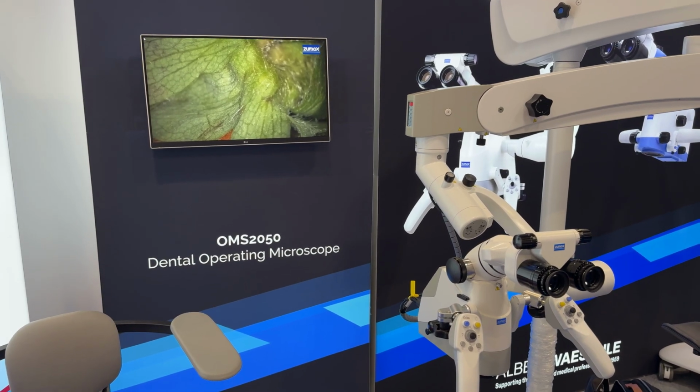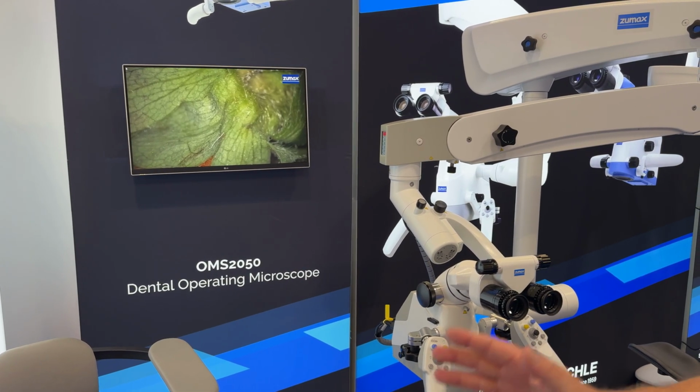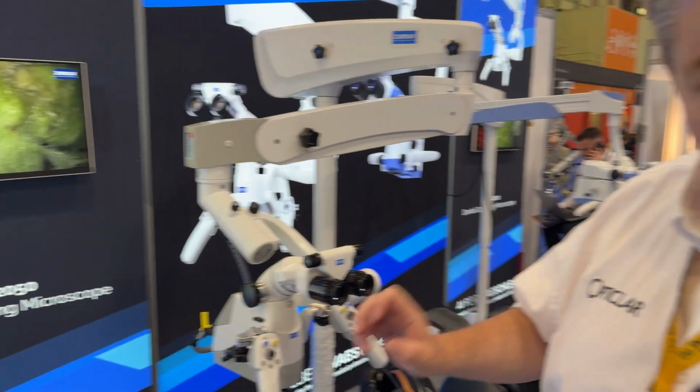It has to be the one that's at the centre of the screen. So if you're actually wanting to look at an object that's towards the outer edges of your field of view, it won't autofocus on that. I must admit, I was trying to work out how the autofocus worked, because when you're looking at something really closely, like the outer of the tooth and the pulp chamber floor, even a couple of millimeters is going to be out of focus. So it'll always focus the centre.